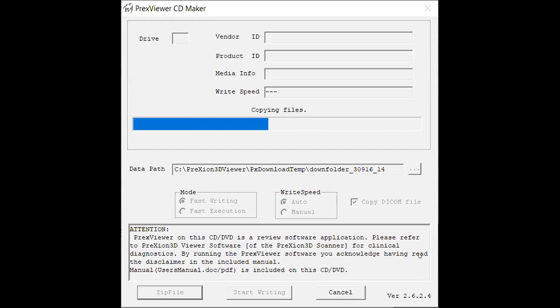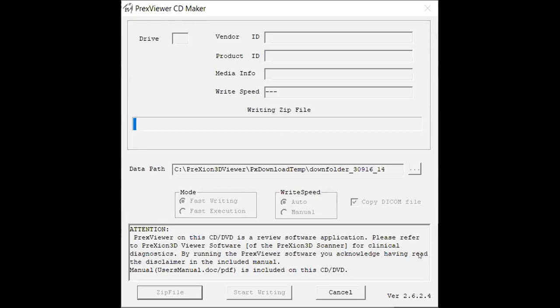Please keep in mind that if you do decide to use a disk to copy the files the disk must be DVD minus R format. DVD minus R. All others unfortunately will not work. And if you use a USB please keep in mind that all files run at about 250 megabytes to two gigabytes and therefore you'll need to have at least, we suggest about three gigabytes of space available on your USB.